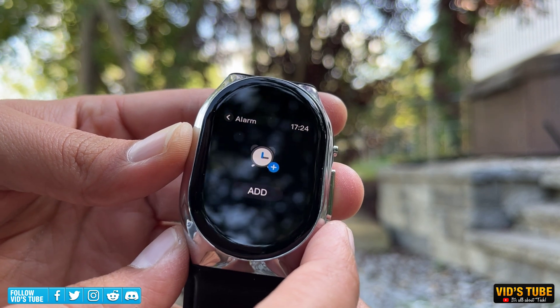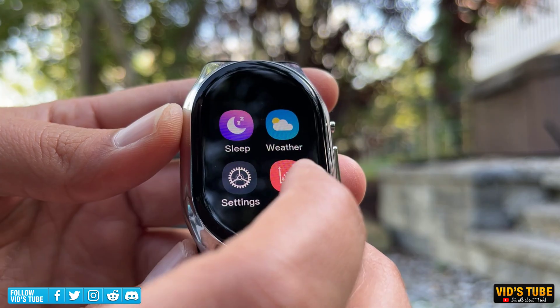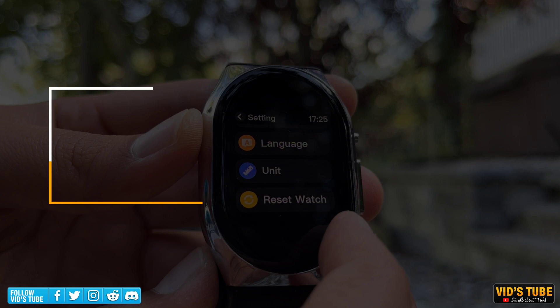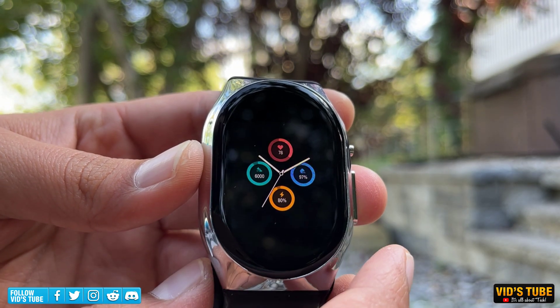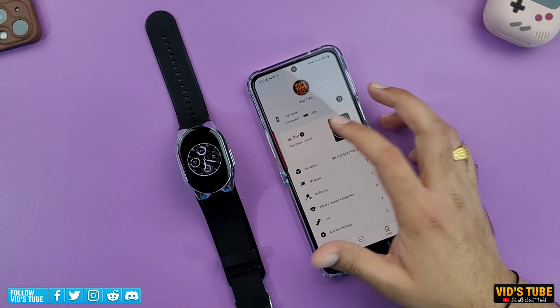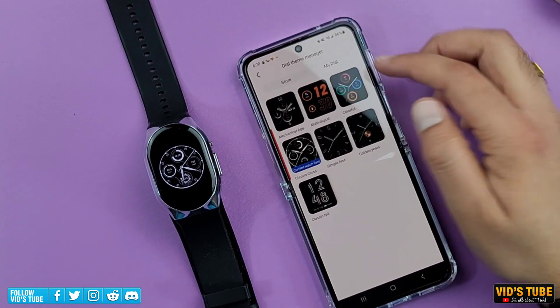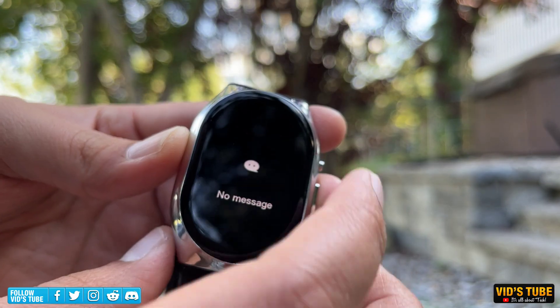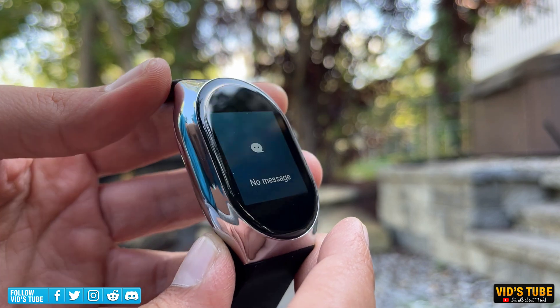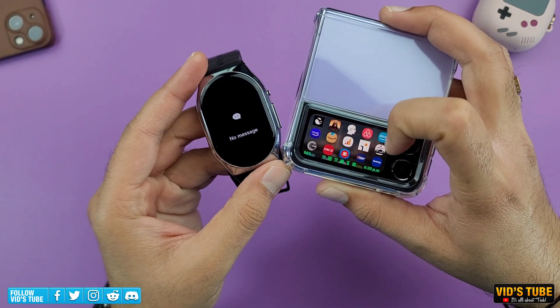The menu includes apps like Alarm, where you can set an alarm straight from the watch, and Weather to check current conditions. You can go into Settings to adjust display settings, alerts, or reset the watch. For watch faces, click and hold the main watch face screen to access the watch face selector. If the preloaded options aren't enough, you can go into the mobile app to add more preset watch faces — though I really wish there were more options. Unfortunately, you don't get call notifications, nor can you answer or talk from the watch, but you do get notifications from all apps, each distinctly marked with its own icon.